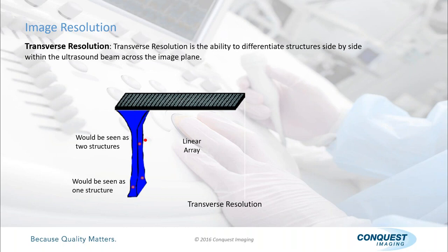So what if, instead of having a solid bar, if you will, a solid object going from front to back through the Phantom, what if it was two marbles, one in the front, one in the back, and I was to put my probe right in the middle? What would I see? Nothing, because I'm not taking a cross section of either one of the marbles, right? In order to see the marbles, then I'd have to change the position of my probe, right? Then I would be taking a cross section of both marbles, and I would see two circles side by side.